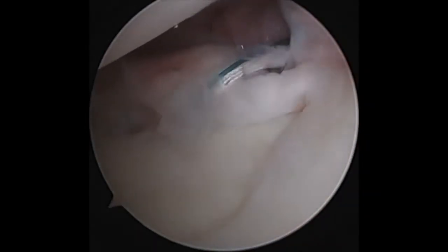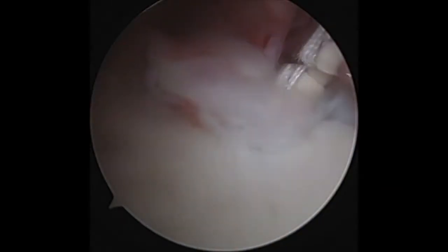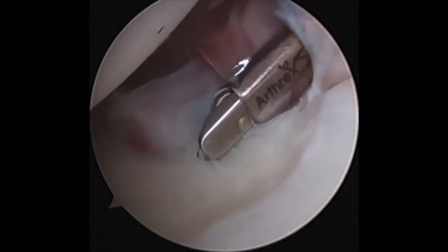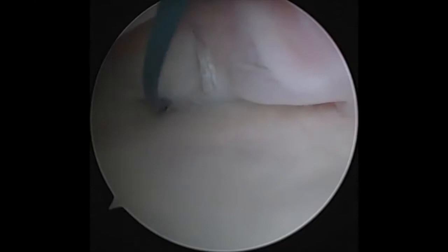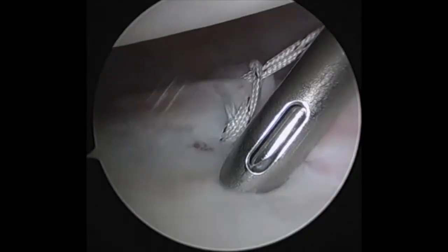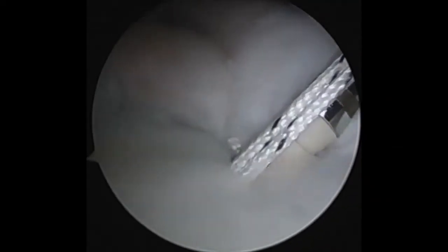I'm then passing a number 2 FiberWire and creating a racking hitch suture. I'm drilling a pilot hole for a 2.9 PushLock from Arthrex, impacting this in to reduce the labrum, then cutting the residual suture. I then repeat the process with the Reel Pass, passing additional suture around the anterior-inferior labrum, drill a pilot hole on the glenoid rim, and then impact the PushLock in to reduce the labrum.